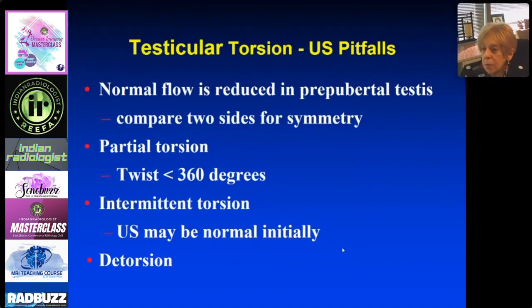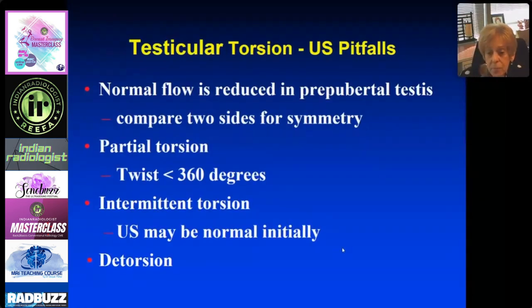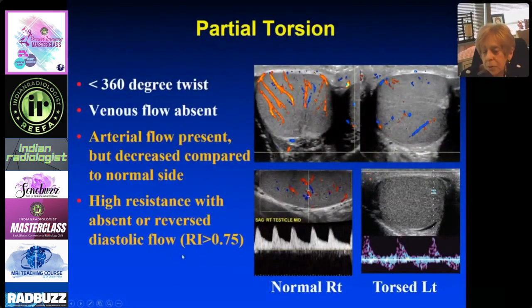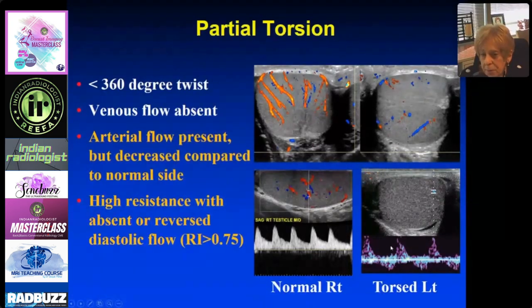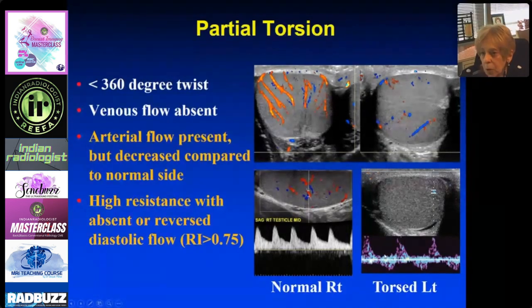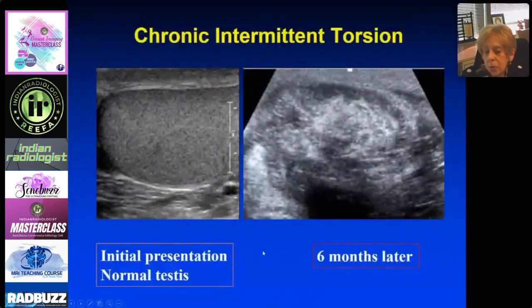Pitfalls: normal flow is reduced in the pre-pubertal testis so you can only compare sides. Partial torsion — a twist of less than 360 degrees — can lead to an erroneous diagnosis. On the affected side, flow is decreased and pulse Doppler shows decreased diastolic flow, reversed flow, and high resistance with no diastolic flow. This represents partial or early torsion. Even though it's not completely twisted, it still went to surgery — it was indeed torsed.